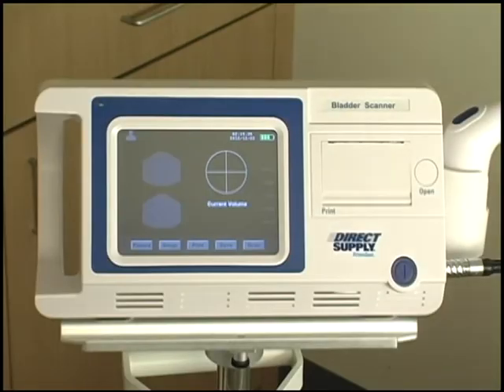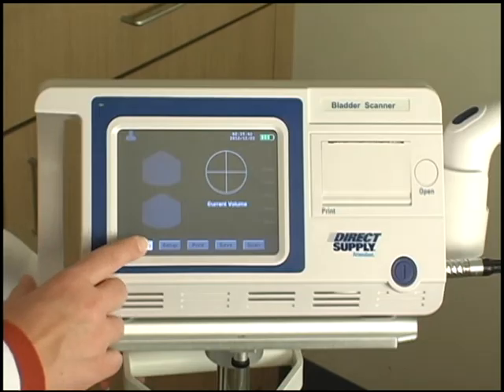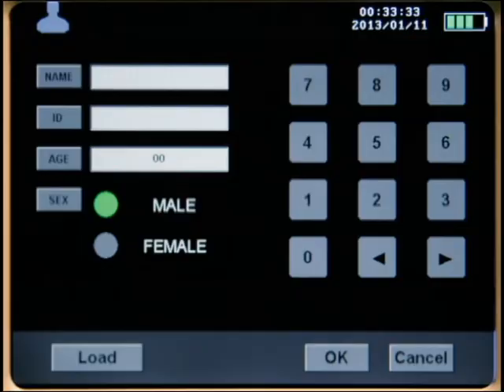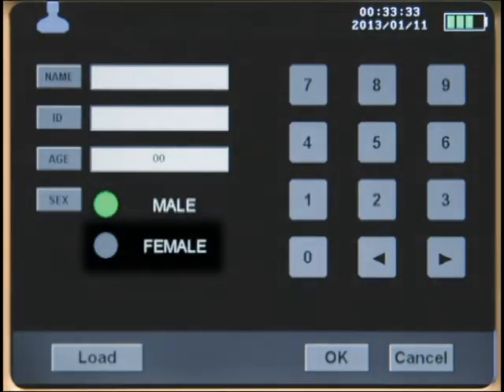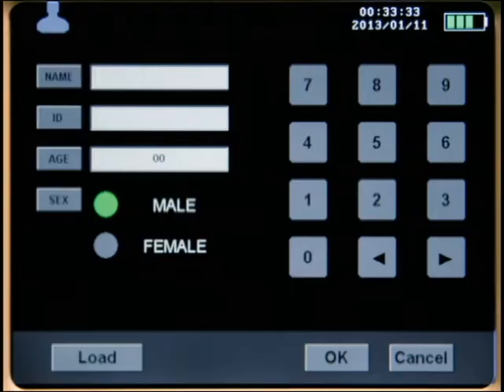To input a patient's information, press the patient button on the main screen to bring up the patient information menu. First, select male or female. The patient gender must be selected correctly because the Attendant Bladder Scanner uses different algorithms for calculating bladder volume based on the gender of the patient.